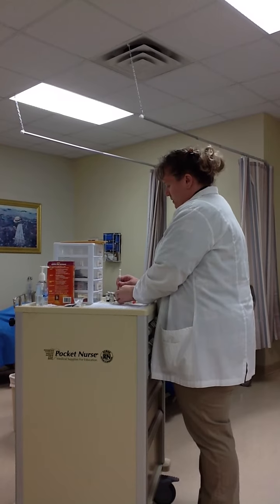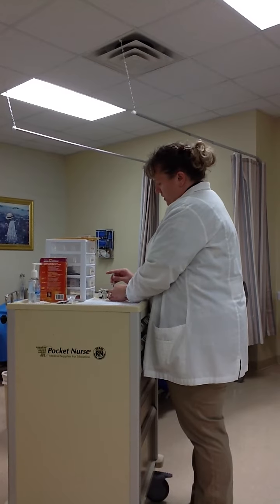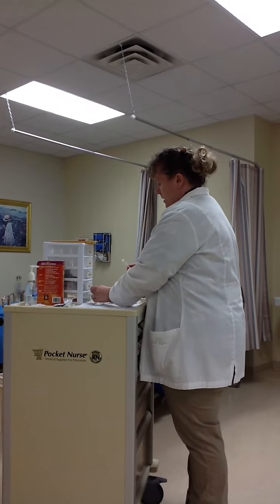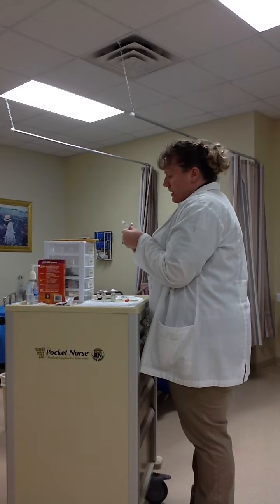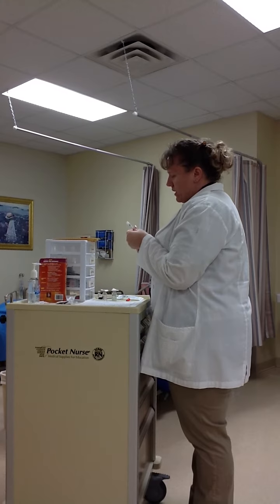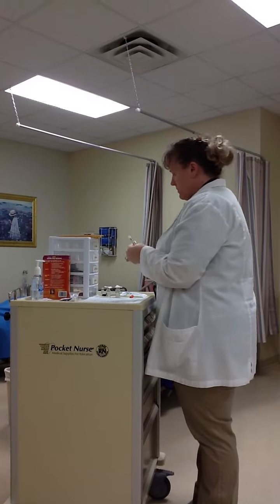I'm going to take that off. Insert that 24 units of air and pull that back out and set that back on top. I then note that I have to have 4 units of regular insulin, so I'm going to get 4 units. Show that to my instructor.